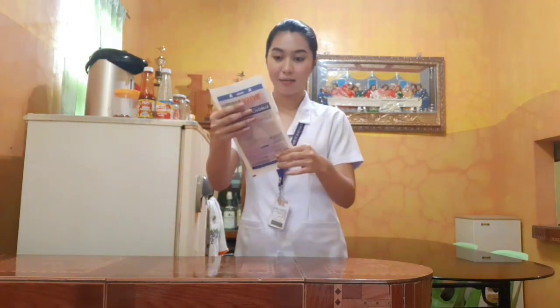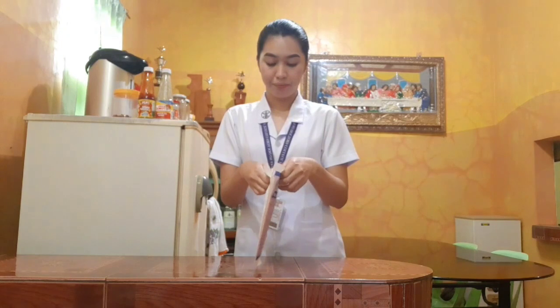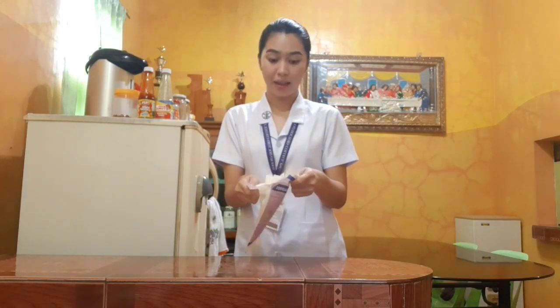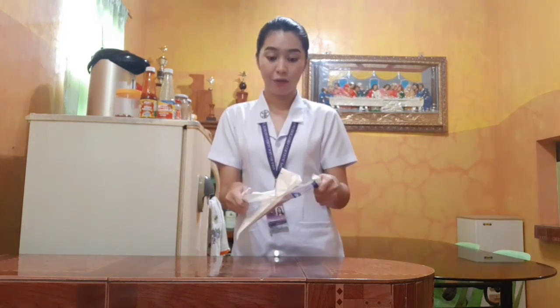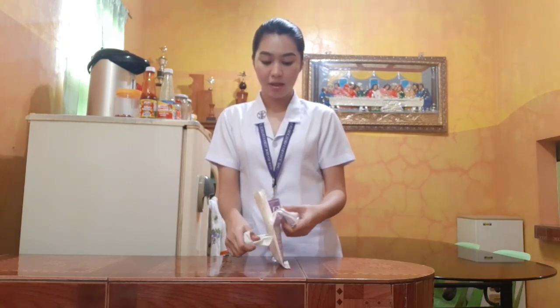Okay, inspect for any tear and stains in the packaging. Okay, there is none. And now that we have confirmed that, we are good to go to the next procedure, which is to remove the outer wrapper of the glove package. In doing so, we're going to separate or peel off the sides without contaminating the inner package. So, be careful not to spill the inner contents to keep its sterility.